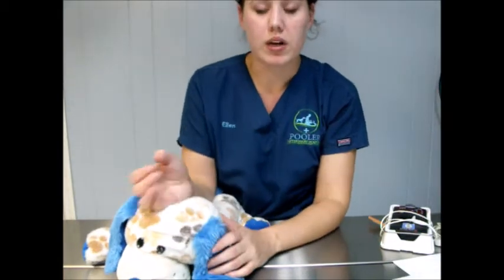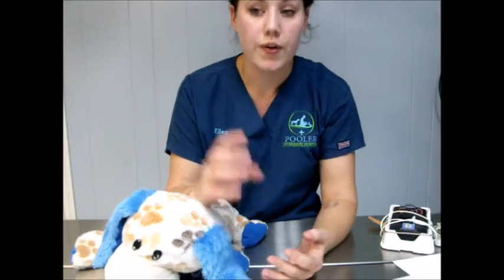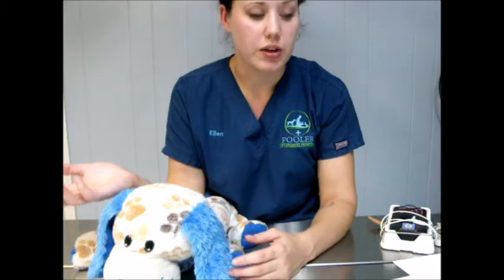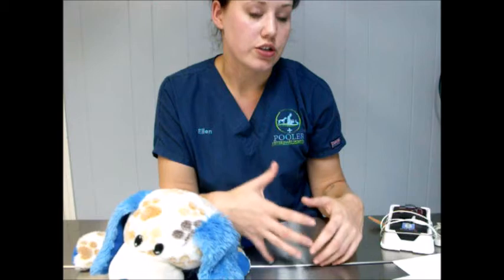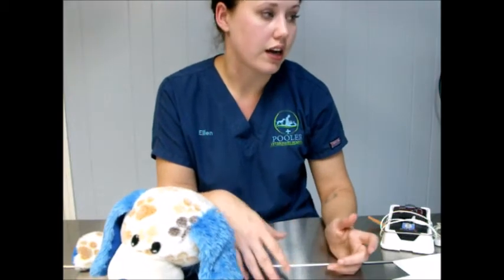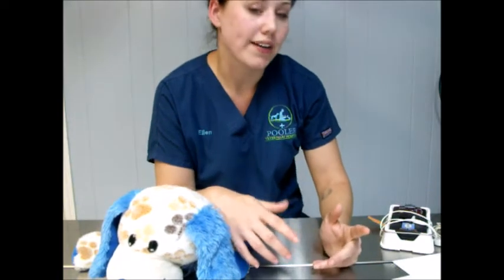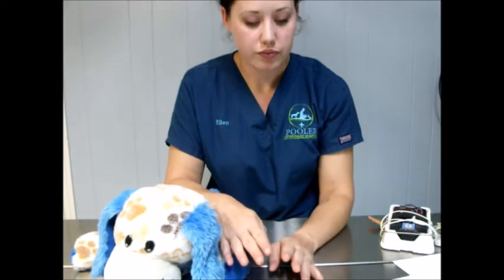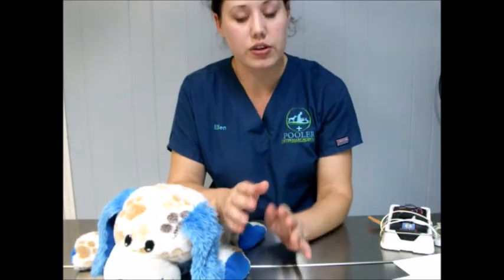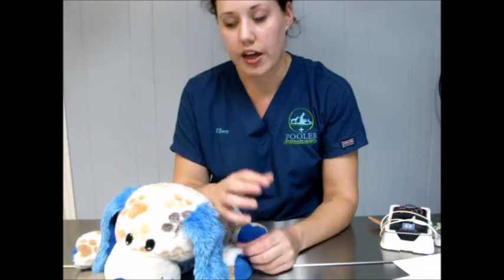So it's a time that you're going to be wanting to be very careful about how you're monitoring everything, that painful stimuli that the doctor could be doing, such as clamping off or making an incision. You don't want the patient to be able to feel it, so you're going to have to increase that inhalant some, but at the same time you don't want it to be decreasing blood pressure or heart rate or respiratory rate and affecting the body functions. So it's a very careful thing that you have to be doing when you're monitoring at that stage, because you want to keep them on that plane. The plane after that is going to be the deeper plane.